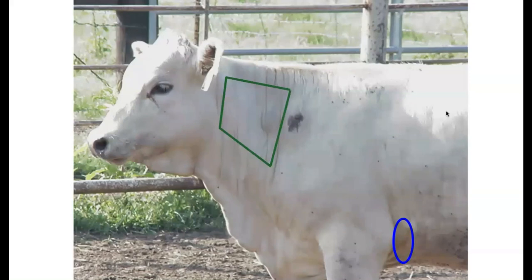If we're giving intramuscular, the only place we're going to give that injection is in the neck. The reason being is even if we didn't give any product, if we just went into the animal with a needle, we can impact the tenderness of the meat around where that needle went in. And so if we have to give an intramuscular injection by giving it in the neck, we grind all that meat up so we don't have to worry about any kind of tenderness issues in those situations. With a sub-Q injection, we can also give those in the neck. And if we give that sub-Q injection right, even if it leaves a little knot, when the hide gets peeled off that carcass, the knot will go with the hide and there won't be any trace left on the carcass there. So sub-Q or IM, we can go in the neck.